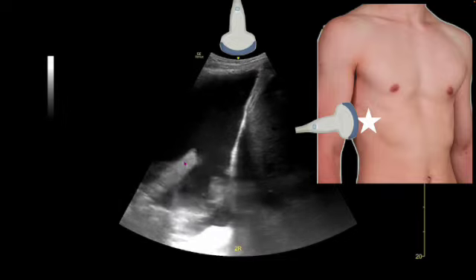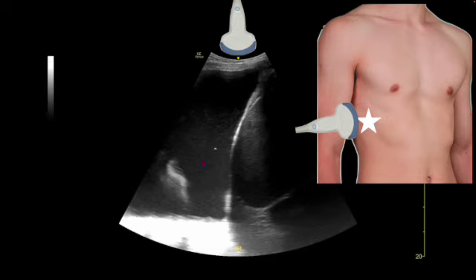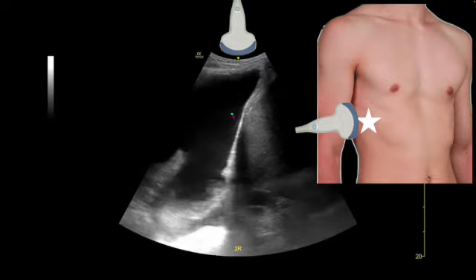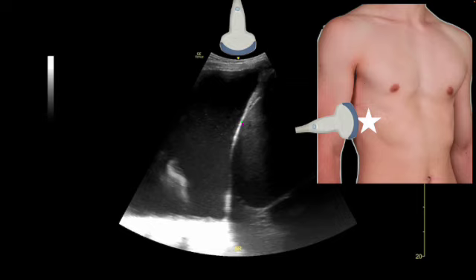And what is this? Here, that is your lung flapping in the breeze, flapping throughout that fluid. That is consolidated lung, right? We call that the jellyfish sign. Again, we don't know if this is transudate, exudate, lymph, or blood, but in the right clinical context, in this patient with ischemic cardiomyopathy, B lines throughout, no trauma, and you see this on both sides, you have pleural effusions and pulmonary edema.